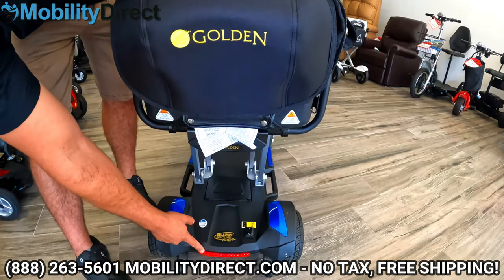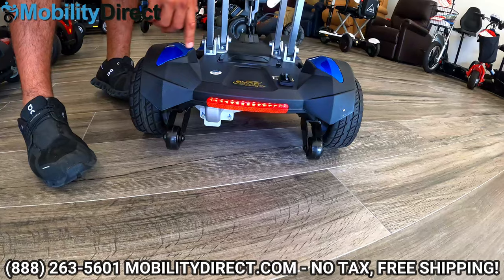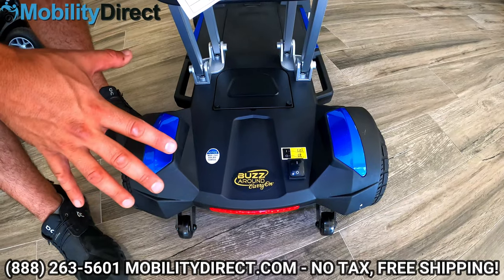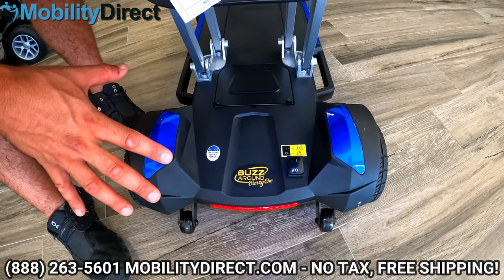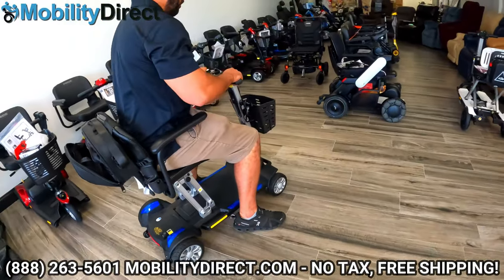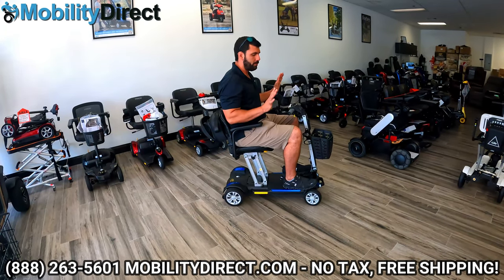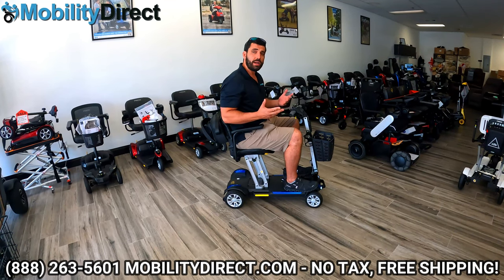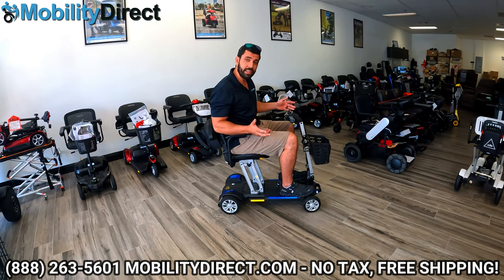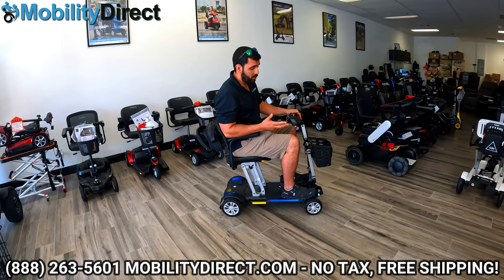The lights in the back also illuminate, and you have the anti-tip wheels. You can get it in red or blue — this one has the blue panels. Here's your automatic brake switch. This does have automatic brakes, which means you don't have a brake pedal or brake handle that you need to use to come to a stop. You just let go of the throttle and it will come to a complete stop. If you do run out of battery on a hill, you're not going to go rolling down uncontrollably. It is a very safe scooter, and it is our top-selling mobility scooter for years, with good reason.